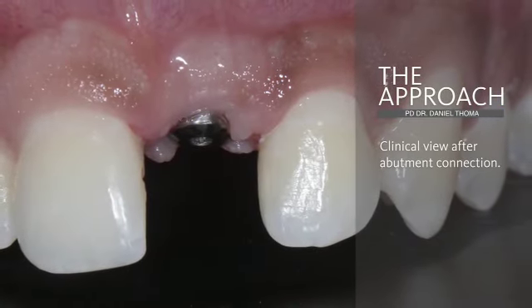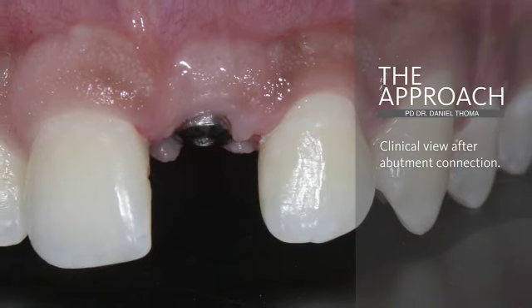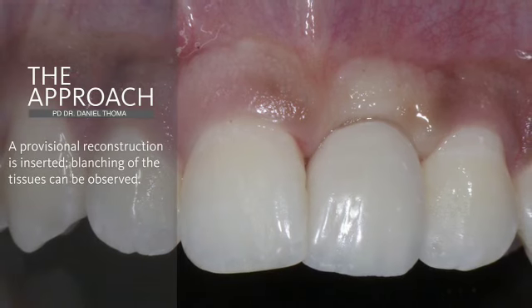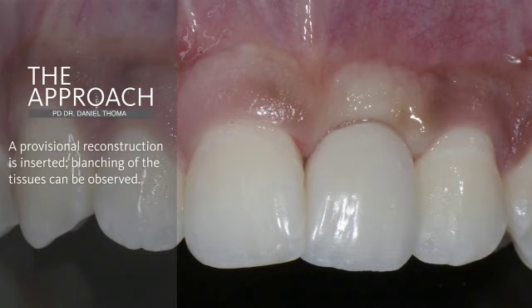Two months later, we can see a clinical view having performed abutment connection. The subsequent step includes then to use a provisional reconstruction fabricated by a dental technician, and by using this provisional reconstruction, we can add some flowable composite and we can shape the emergence profile. Here we can already see the blanching of the tissues due to the pressure of the provisional reconstruction.